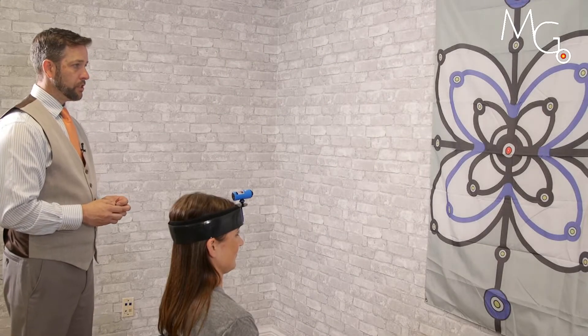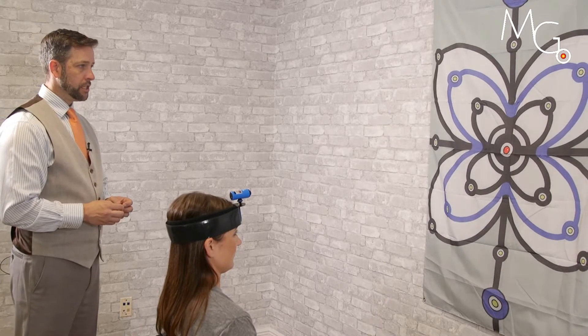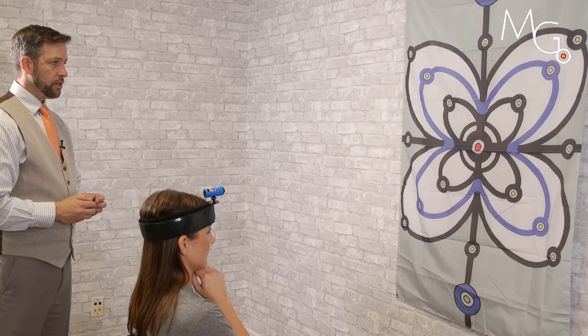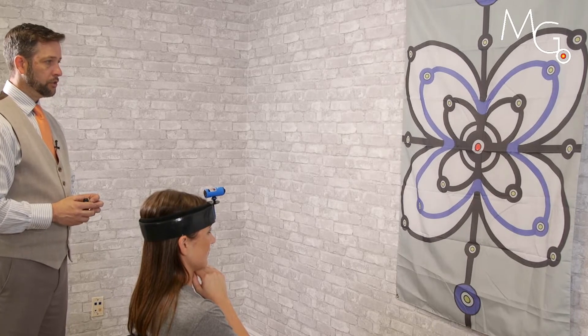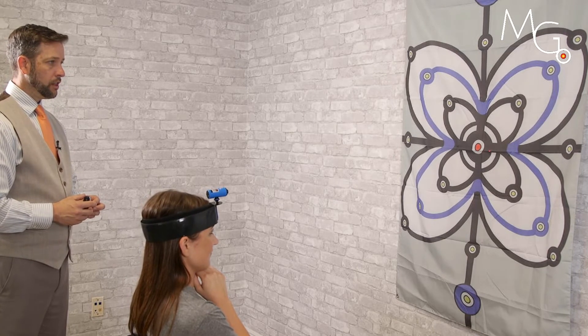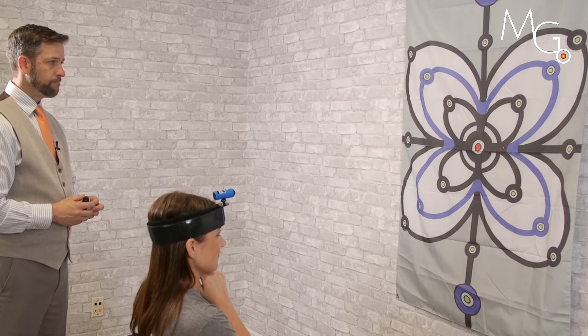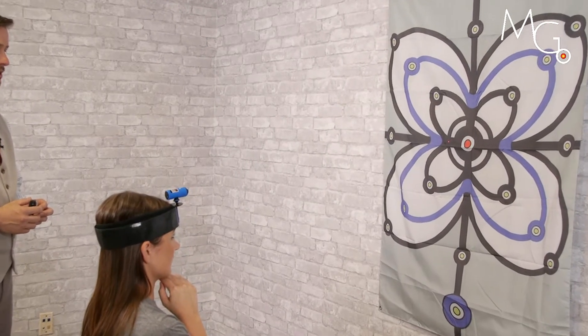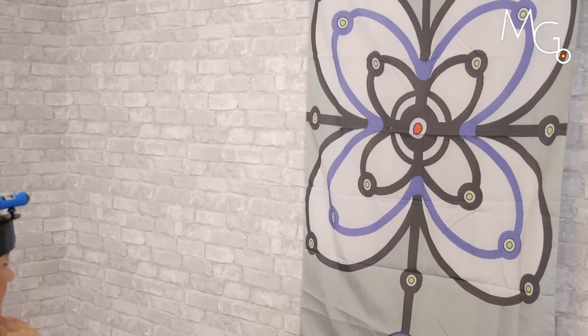Side-to-side head movements can also be performed with the laser, with the patient sitting or standing. Instruct the patient to keep their chin level or parallel to the floor, then move the head and ear toward the right, back to the middle, to the left, and back.